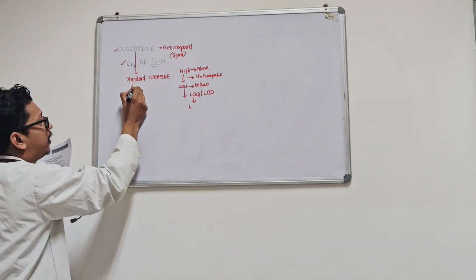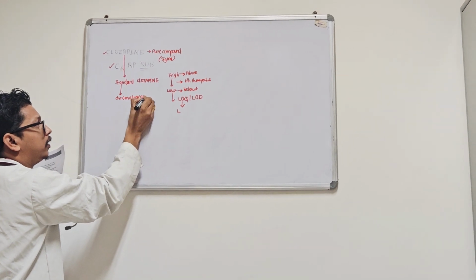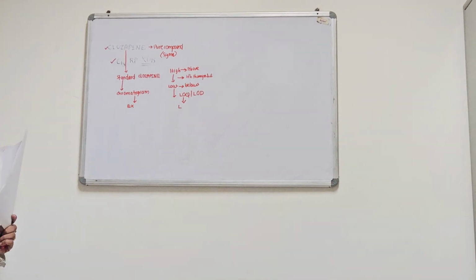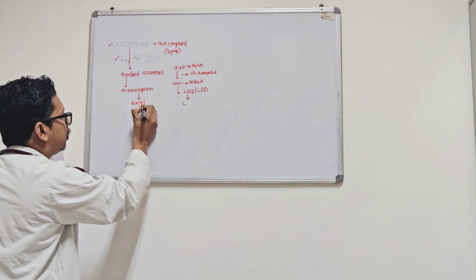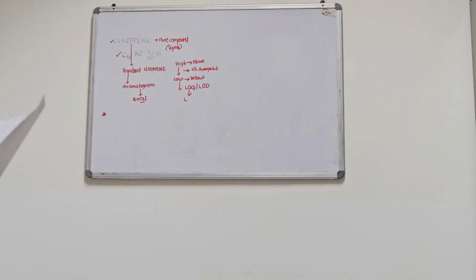After that we ran it and got the chromatogram. We have explained about the chromatogram and its properties also. After that, from the chromatogram we took the AU, took the concentration, fed them into Excel, and checked the linearity. The R square is also good. Then, once the whole standard is made, we have to extract the compound.